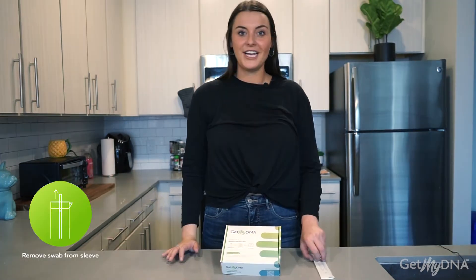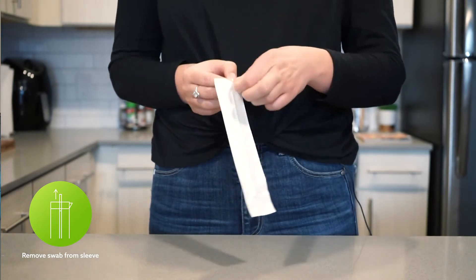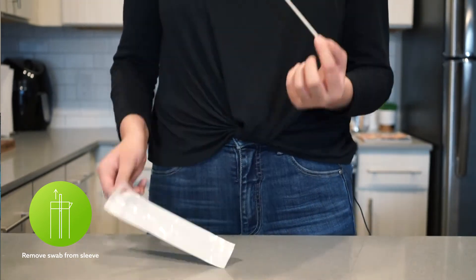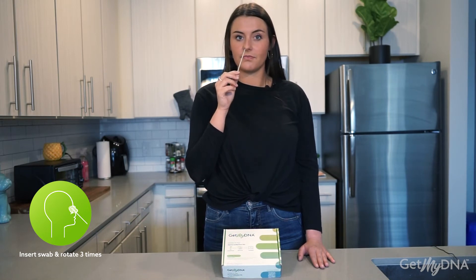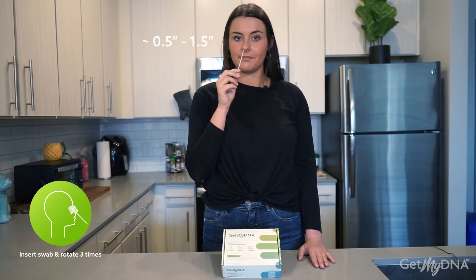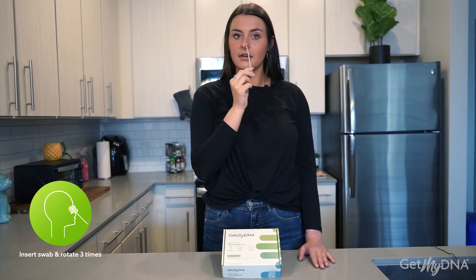Now you're ready to begin the collection process. Locate your nasal swab provided to you in your kit. Please note the open arrow. Remove your nasal swab with the tip facing down. Gently insert the swab into one nostril, one centimeter to three centimeters deep. Rotate the swab three times and then repeat on the other nostril with slight pressure.